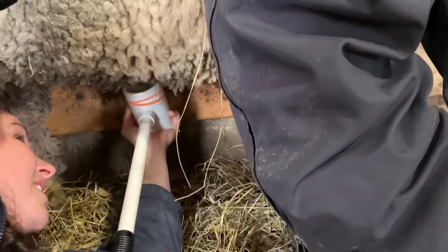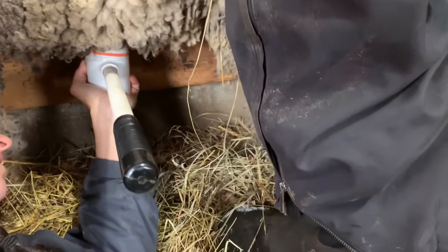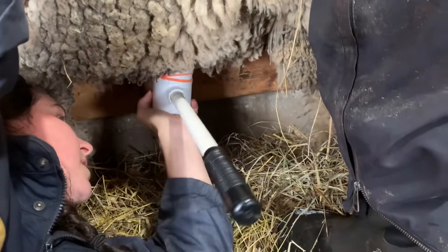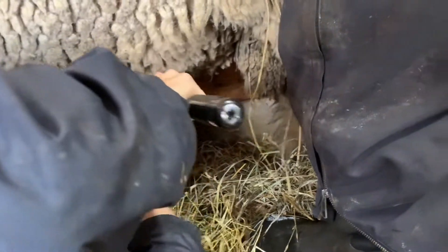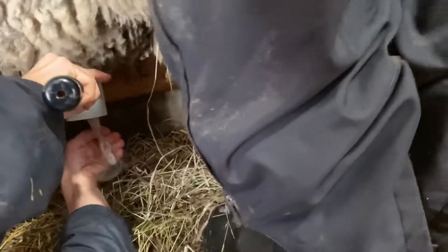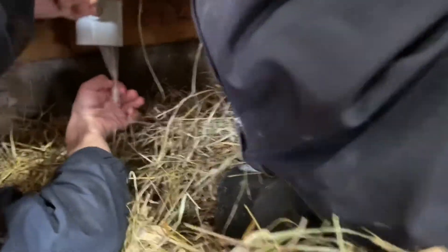That means it's a better ram — which is just a male sheep. Did you not get anything? I can't see because I have it covered. That's the warm cone that we're trying to collect the semen with. I mean, I got quite a bit.